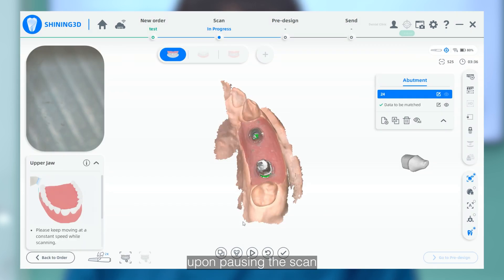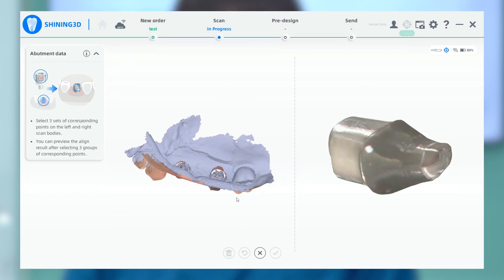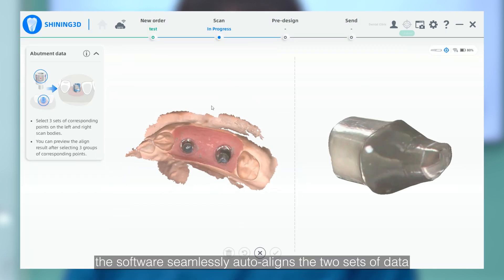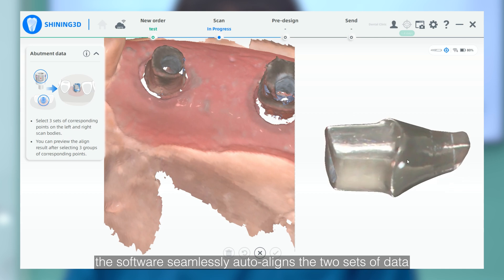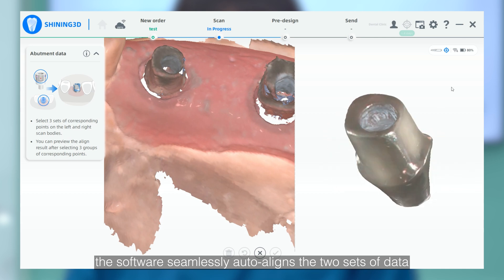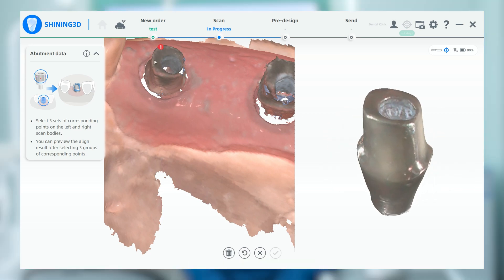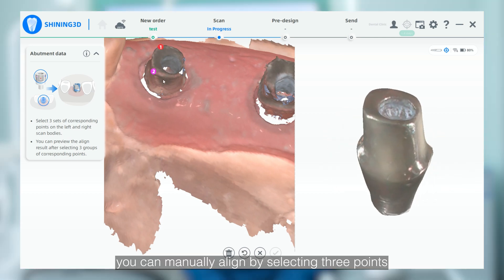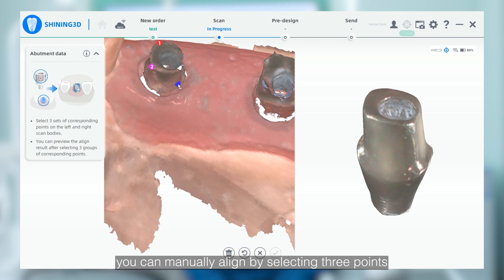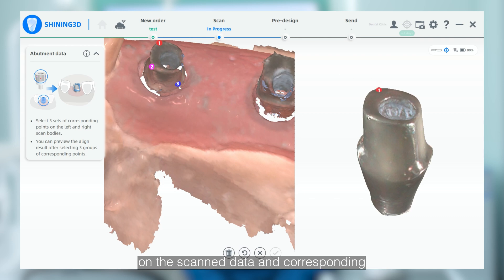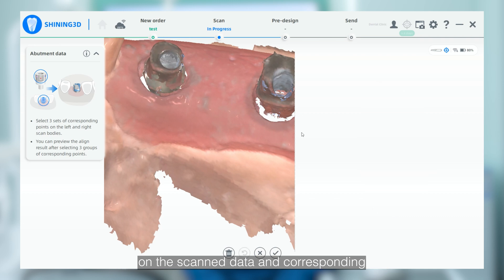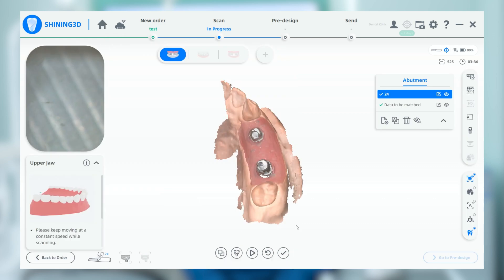Upon pausing the scan, the software seamlessly auto-aligns the two sets of data. When the auto-alignment falls short of perfection, you can manually align by selecting three points on the scanned data and the corresponding points on the imported data.